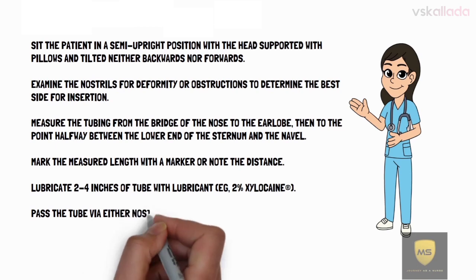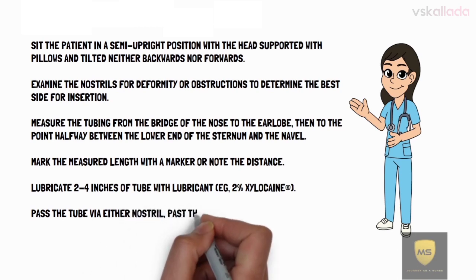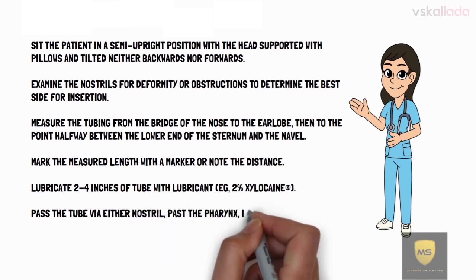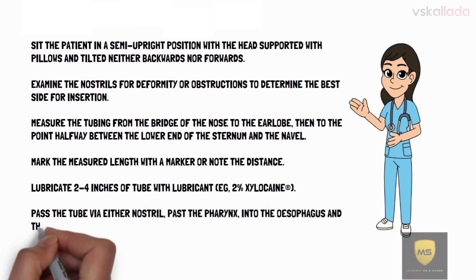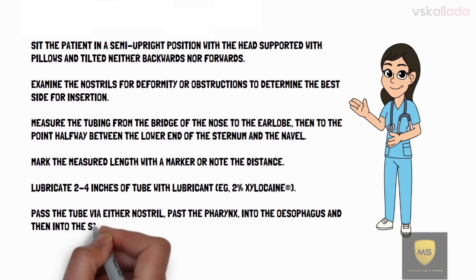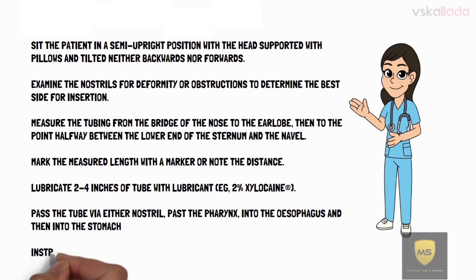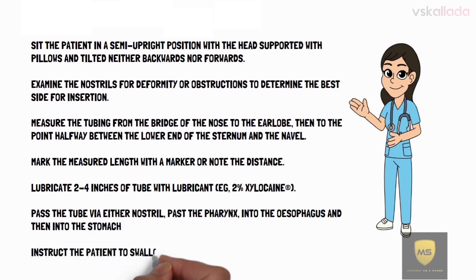Pass the tube via the nostril, through the pharynx and esophagus, and then into the stomach. Instruct the patient to swallow if the patient is conscious.